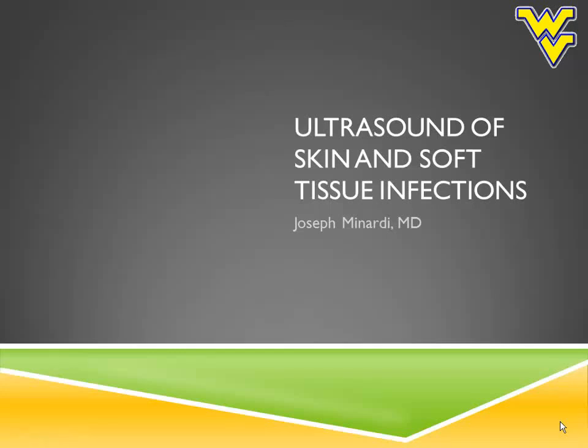This is Joe Minardi coming live from my WVU Emergency Department recording studio, and I've got a little bit of info for you today on ultrasound of skin and soft tissue infections. Sometimes I like to start off with a case, and that's what I'm going to do. Here's a case. You've probably seen similar ones in the past.